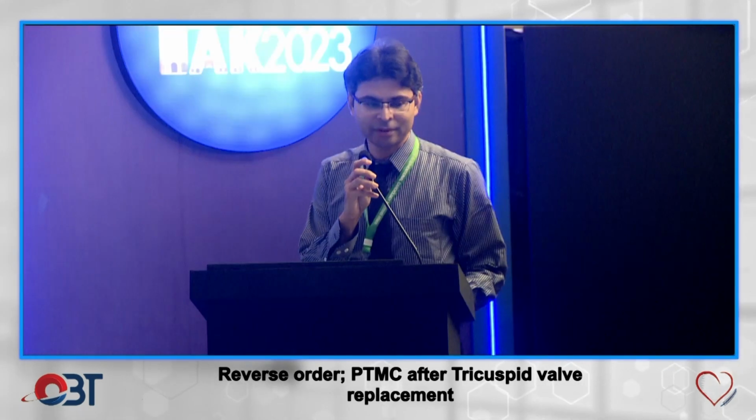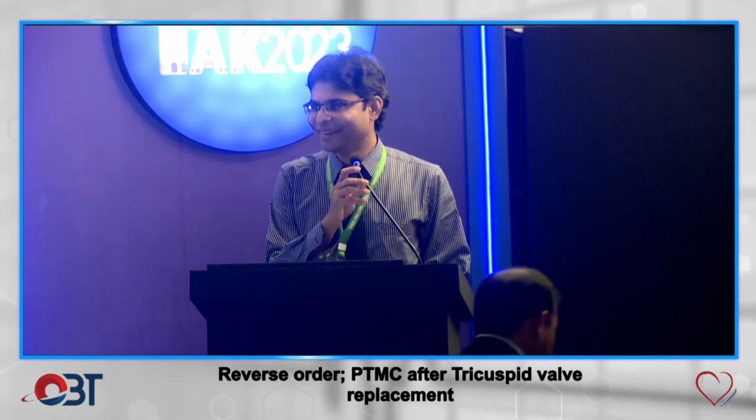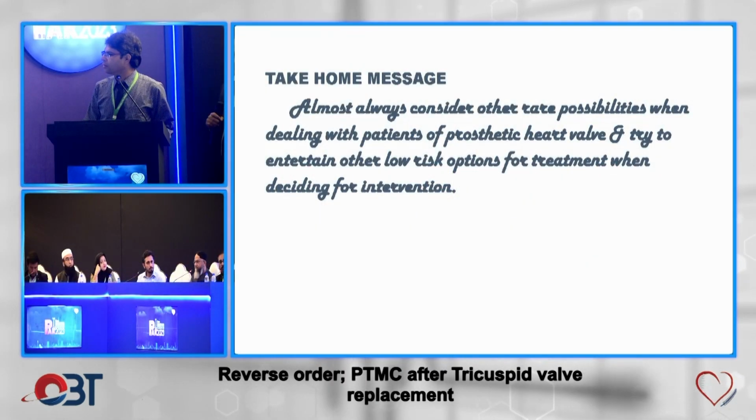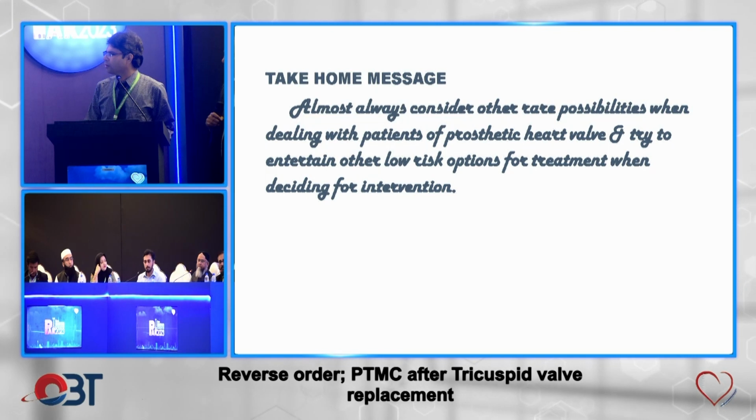Why were other options of tricuspid valve replacement not taken on board? Like bioprosthetic tricuspid valve replacement rather than any mechanical valve, because it's low pressure chambers RA and RV, and it may cause a higher thrombogenicity in those cases.